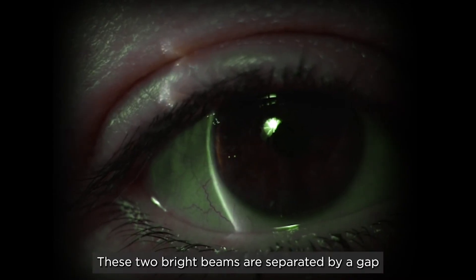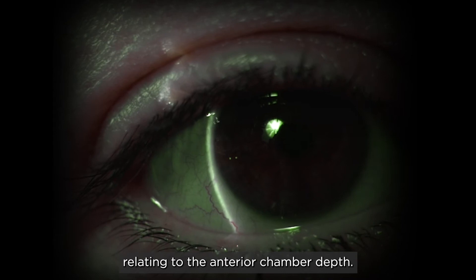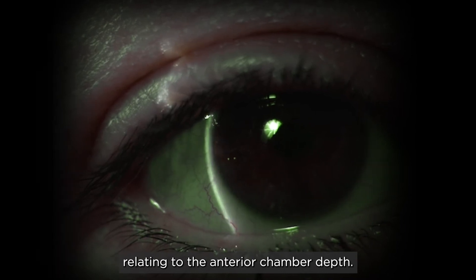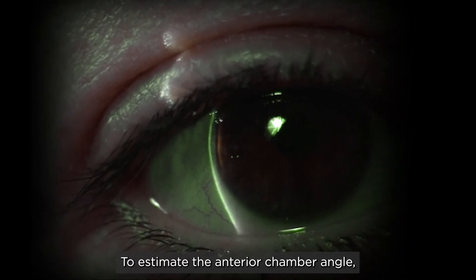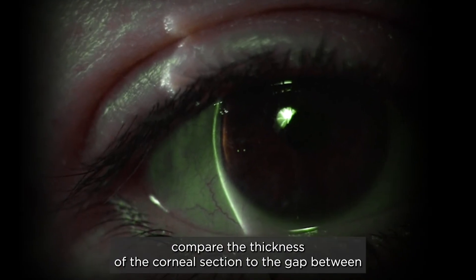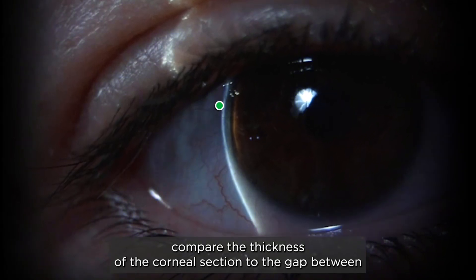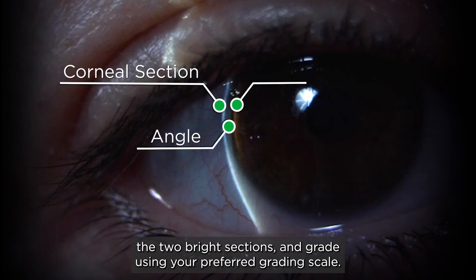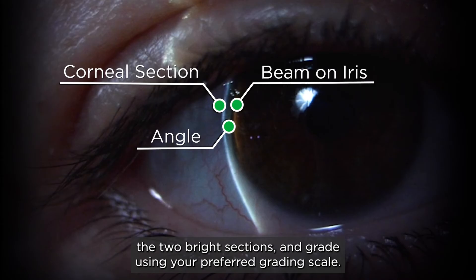These two bright beams are separated by a gap relating to the anterior chamber depth. To estimate the anterior chamber angle, compare the thickness of the corneal section to the gap between the two bright sections and grade using your preferred grading scale.